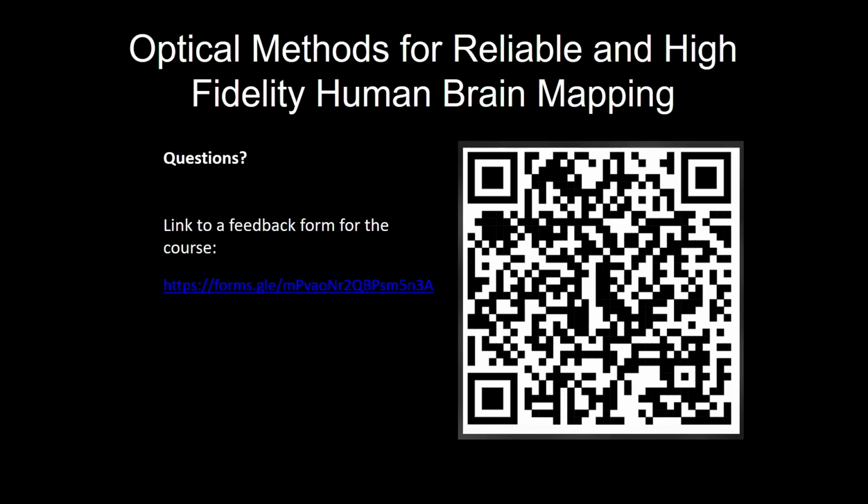I can testify that my 15-month-old son wore it for about 2 hours while he was sleeping in his buggy, and it was absolutely fine. He had no marks, and the cap that I showed you also had EEG embedded to account for the sleep stages. So I think that's absolutely doable. I don't know if there are studies that did that over a whole night. I don't know if my colleagues know about that.